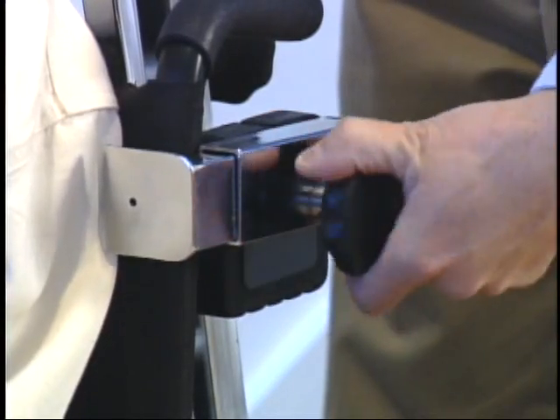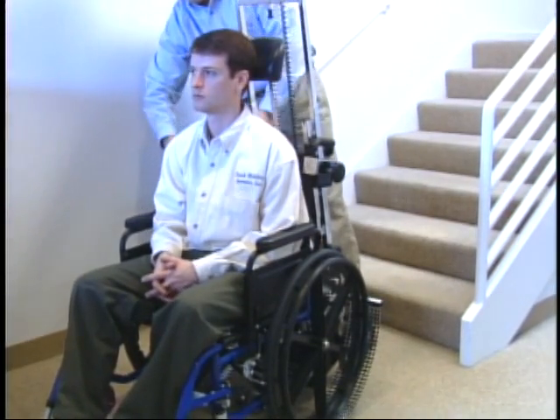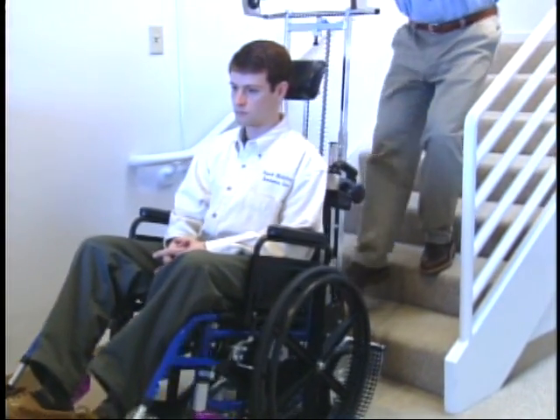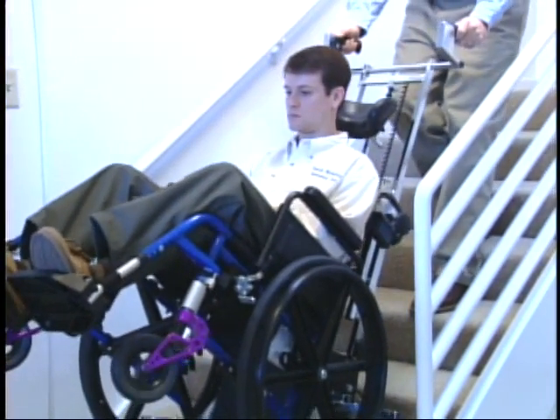This stair climbing solution eliminates the need for wheelchair modifications by having a quick-release clamp for the wheelchair backrest. The Scattermobile provides portable stair climbing solutions at home, in the community, at work, and while traveling.